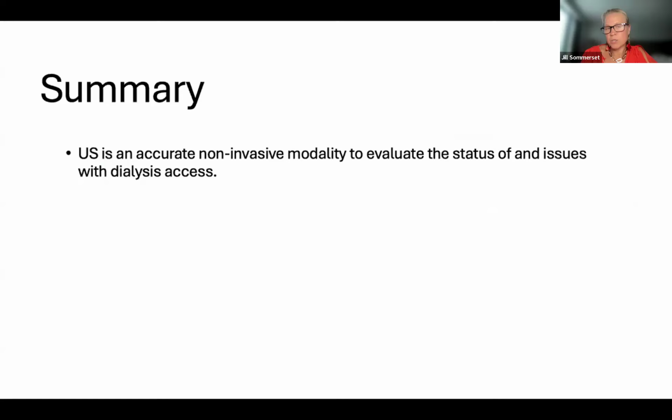So in summary, ultrasound is this really nice tool to not only plan, just as Carrie said, it can really be a helpful tool in planning for our dialysis access procedures. We can go through this protocol pretty efficiently and accurately to say, where are we going to place this AV fistula? What is the plan and what's best for the patient?